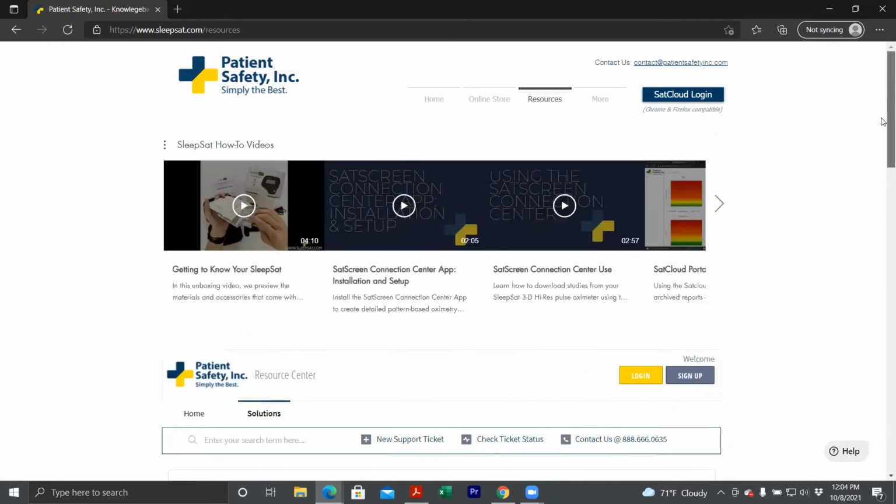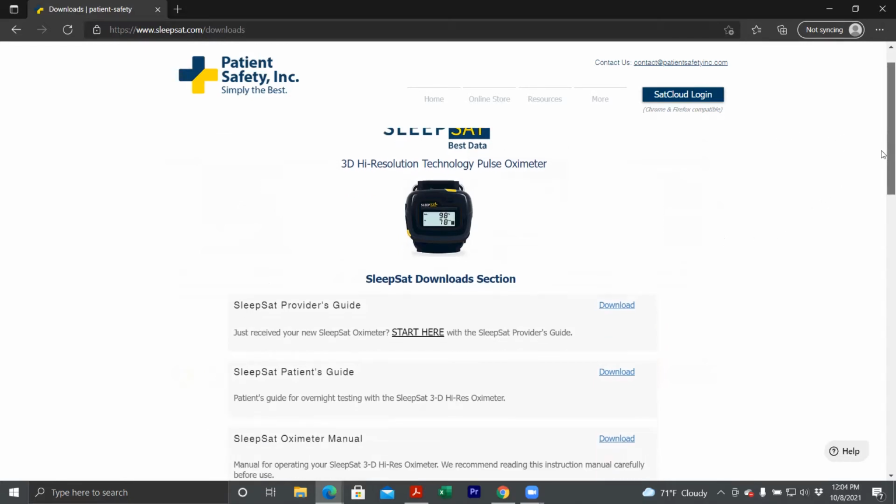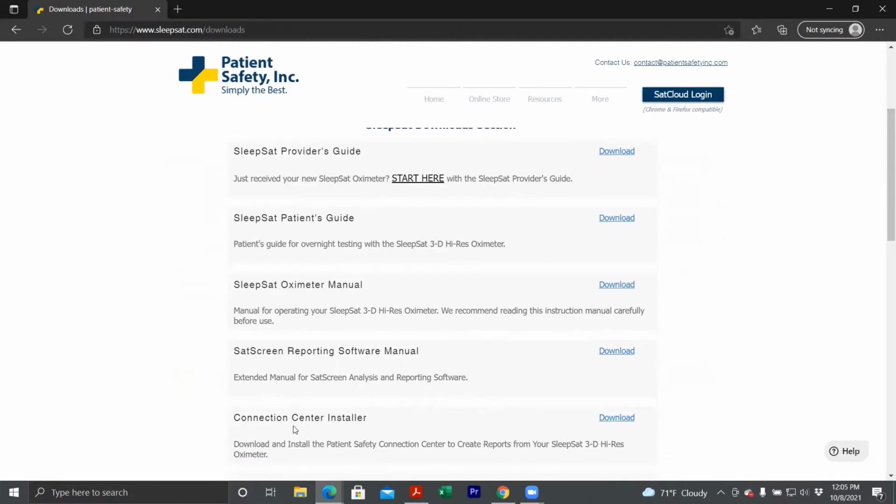Before moving on to the patient video, I do want to show another feature here on our website under more and then downloads. We do get asked pretty often if the SatScreen Connection Center can be on more than one computer, and it can. That can really improve the efficiency of your screening process in your office, as you know, if you're not having to sit down at the same computer every single time, if someone's handling another office process at that point. Here under downloads, we're looking for the Connection Center installer.